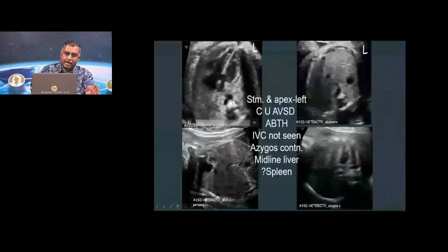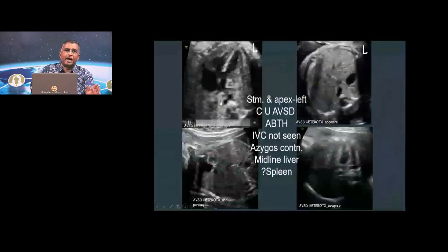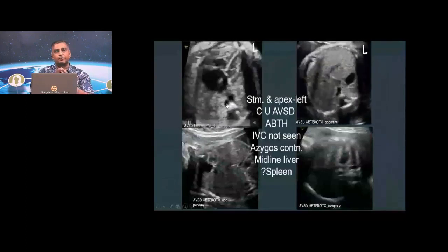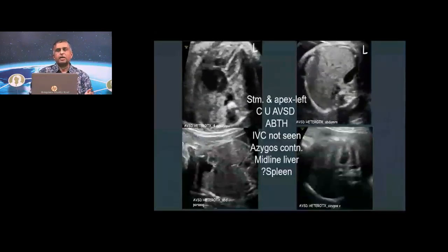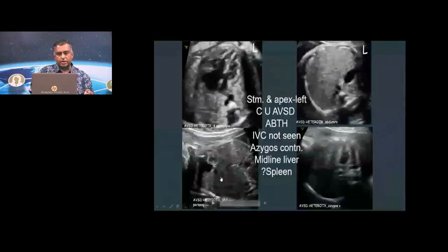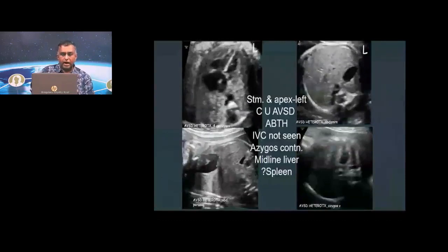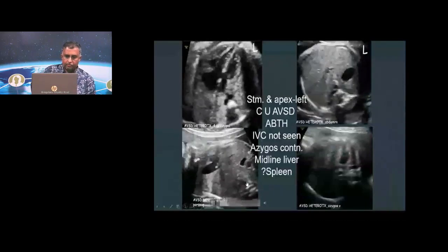That's the pulsatile descending aorta. Do you see a second vessel here which is not pulsatile? That is the azygous vein which has really become big, and this is not an abnormal vein. It's a normal vein. It becomes big, and you call it an azygous continuation, which is taking the abdominal venous return into the SVC.